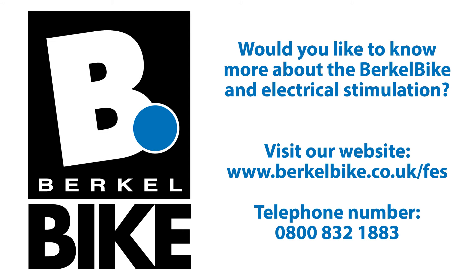Would you like to know more about the BerkelBike and electrical stimulation? Visit our website for a free test ride.